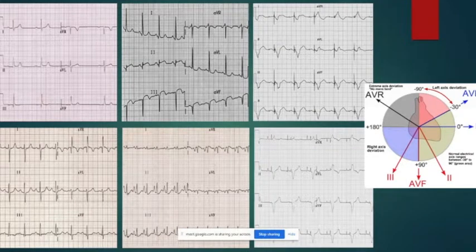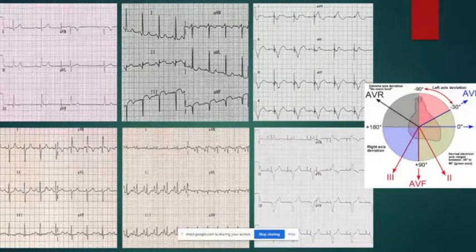Professor, do you just use one R to R interval, or do you do an average? When you have almost equal R intervals, you don't need to use an average. You need an average R interval when you have atrial fibrillation, because you have different RR intervals, so you have to take at least 5 and average them and then divide it, because at some point you don't have constant AV blocking in atrial fibrillation, so the conduction every time is different, so you have different RR intervals.